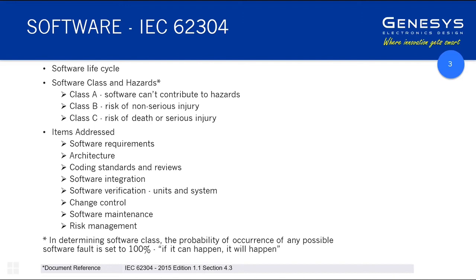And again, I think it's an activity that has to be done by the development team, be they software engineers, industrial designers, the people doing the graphic design. You get the right people in the room, you get a much more nuanced approach to getting the thing right.